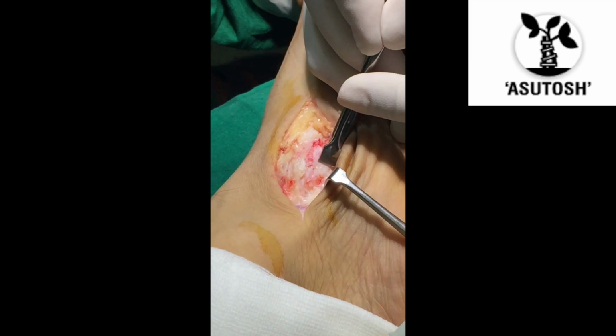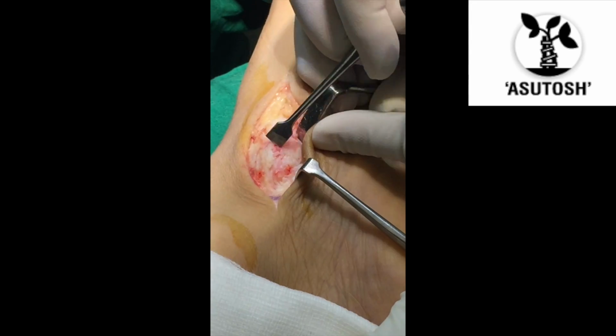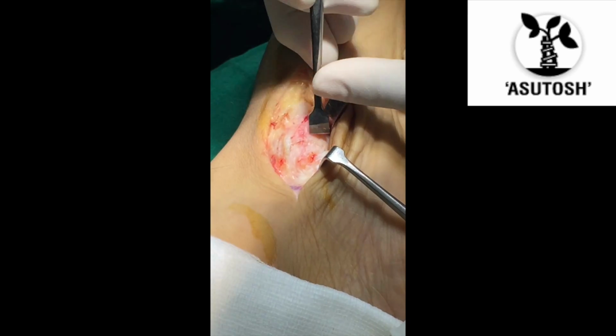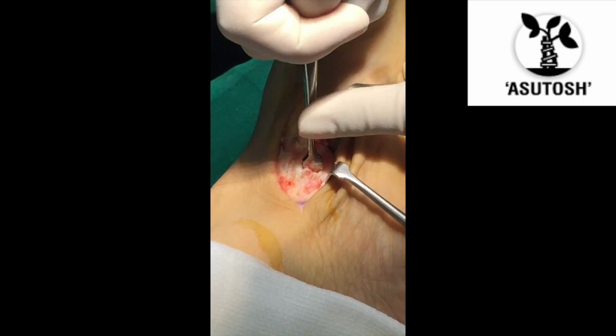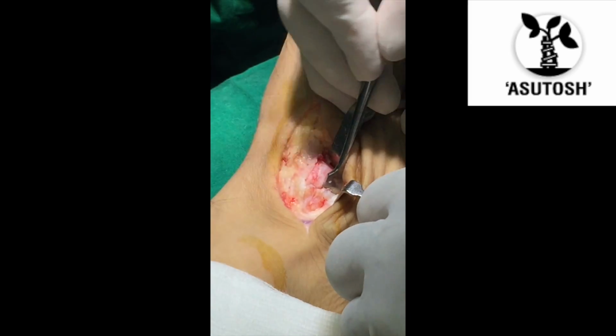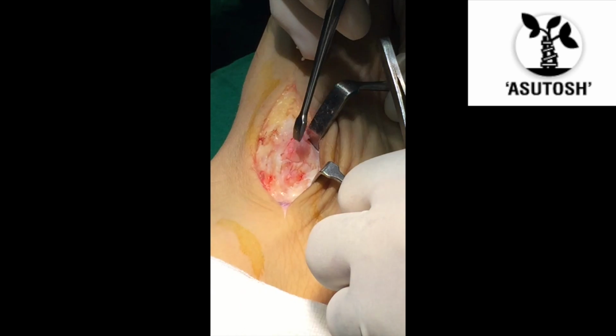And now with the help of a small osteotome, we are going all around the accessory navicular portion that we can see. With the help of an osteotome, we are gently dissecting out the accessory navicular from its surrounding normal structures that we can see, the normal navicular.